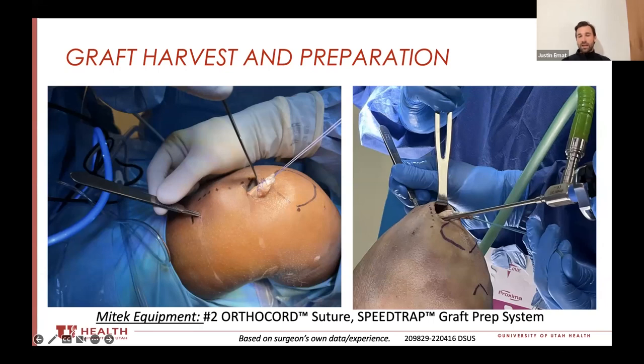If I'm doing a full tibial tunnel, it's the same logic on the femur — I'm going to bottom it out and tension down my rigid loop BTB button. The big mistake is when people put the interference screw only as far as the outer cortex of the tibia, but when you have a short graft the screw won't grab enough for secure fixation. While I'm putting that screw in, I stick the scope back into the knee and look down the tibial tunnel, basically driving that screw in until I see the graft and screw meet at the very aperture of the tibia — that maximizes fixation, getting at least 20 millimeters of graft connected to that screw.